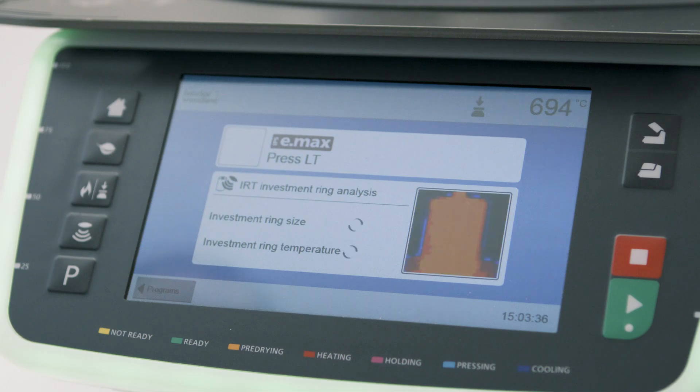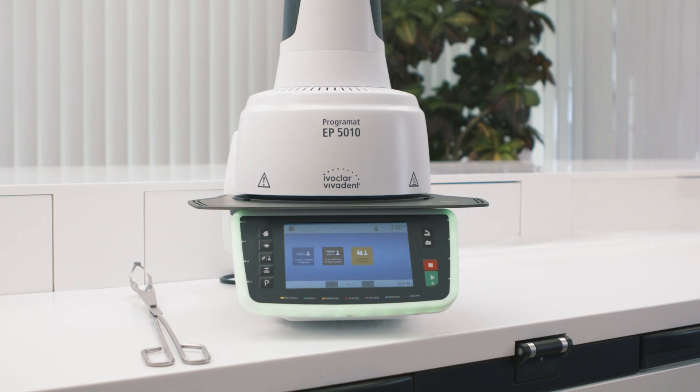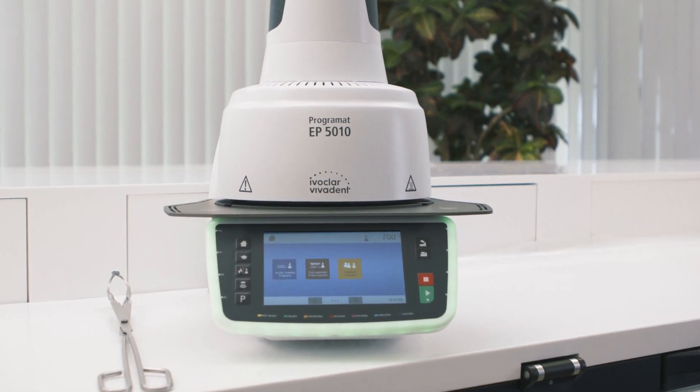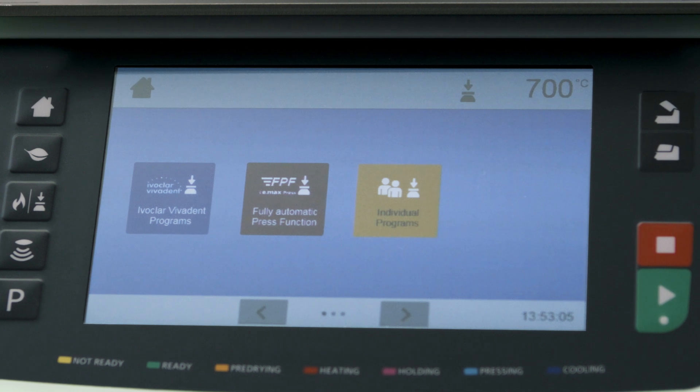The infrared technology of the Programat Furnaces was specifically developed further for use in the Press Furnaces. The following shows other functions which are also possible with the EP5010 G2: FPF Function, Conventional Press Function, and Individual Programming Options.